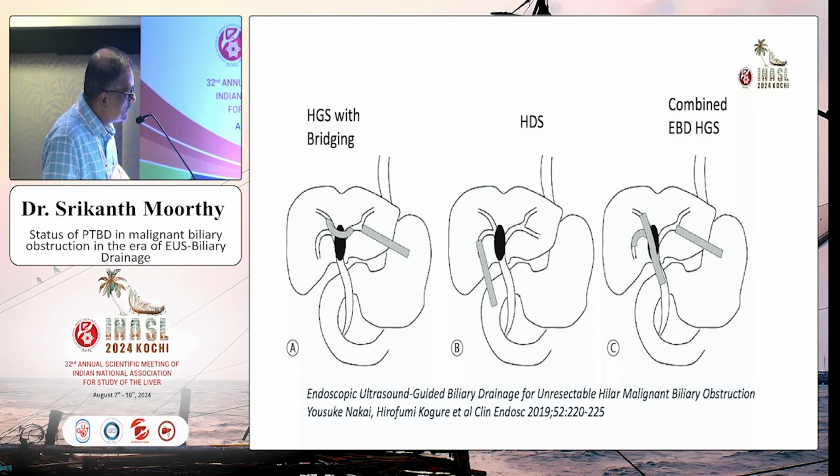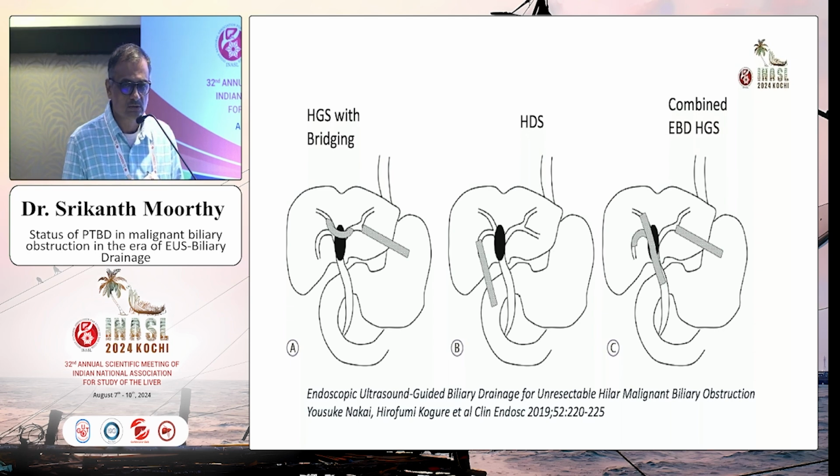But of course, this is the easiest way you can do US guidance, that is, approach the left system. The right system is more challenging. So many times when you have to drain the right system, you may have to cross and put in a stent from the right to left, which is called a bridging technique. All that is technically very challenging, but that's how we do it. Or the best way is to do combined ERCP, so you just put in this stent with the US and then do the rest of it with the ERCP, so you get drainage of both sides.